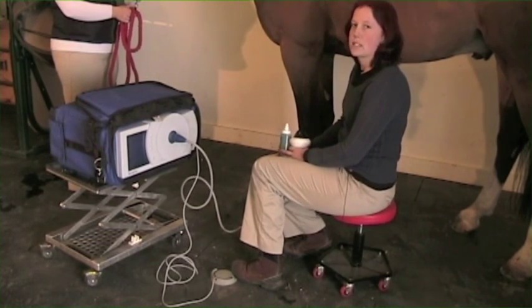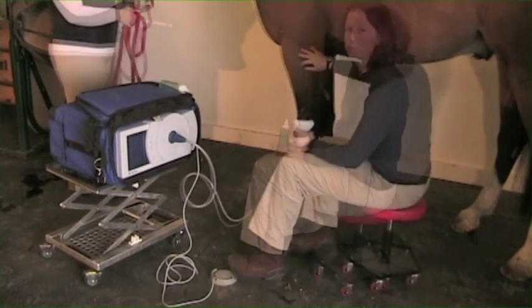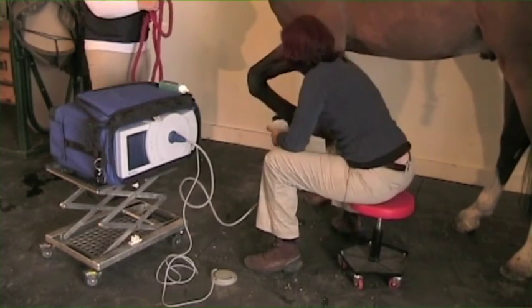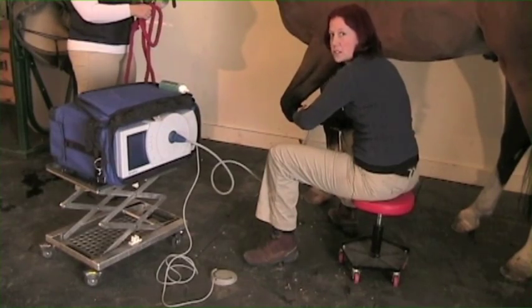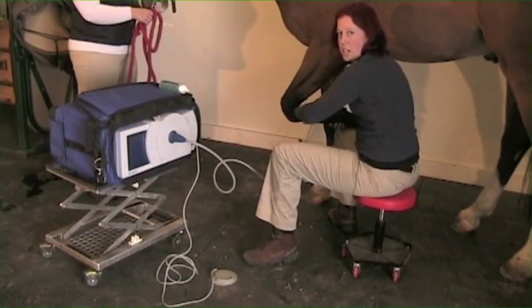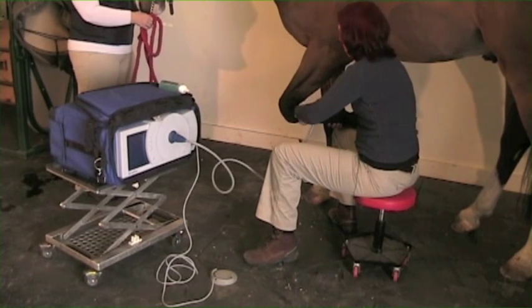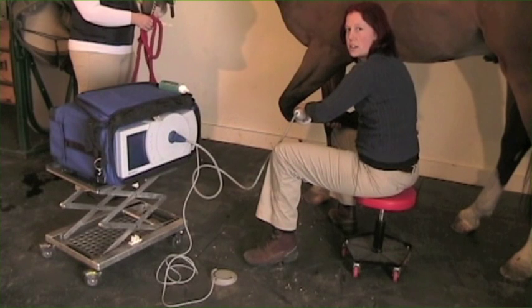The procedure typically lasts about five to ten minutes, depending on how many shocks we're putting into an area. You would then apply the probe to the affected area and shockwave for the number of shocks needed for the specific injury. The nice thing when we do shockwaves on splints is that it will actually treat the calcification of the splint bone that is happening, but also it will treat the surrounding structures that are being irritated and inflamed because of the splint itself.